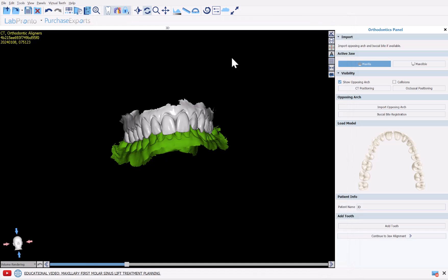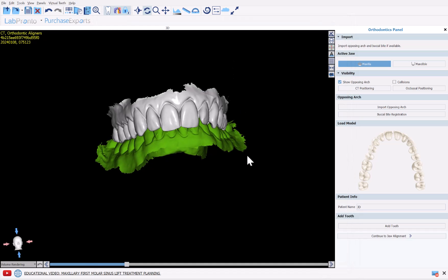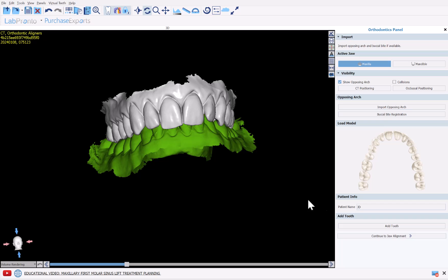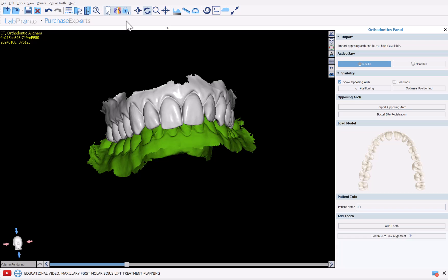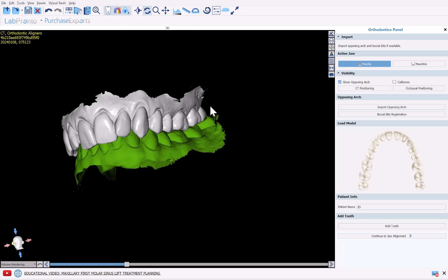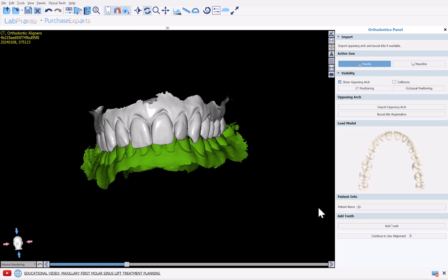I'm going to click cancel. At this step, there are two important things that we want to be doing. Number one is we want to enter a unique patient identifier. The unique patient identifier that you enter here will be the default suggested option when you're saving the case, when sending the case for aligner manufacturing, when you're sending the case to BlueSky Monitoring. It's just going to be the default suggested name for everything connected to this patient in this patient case.